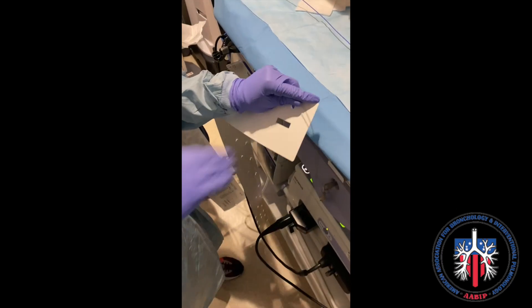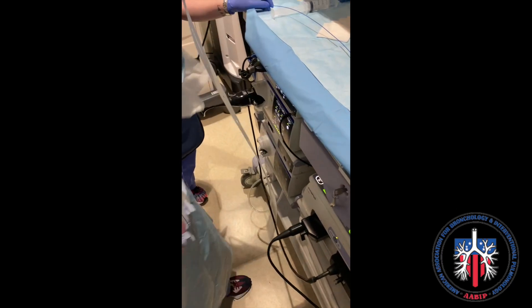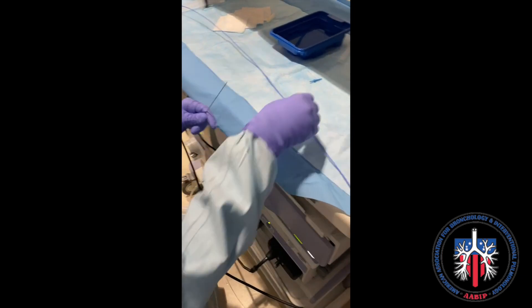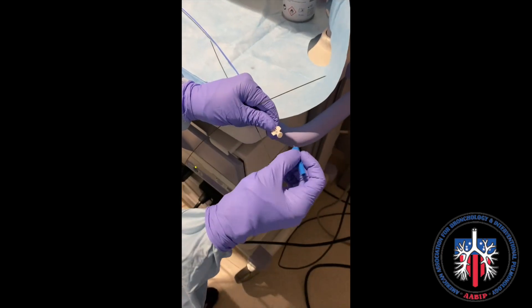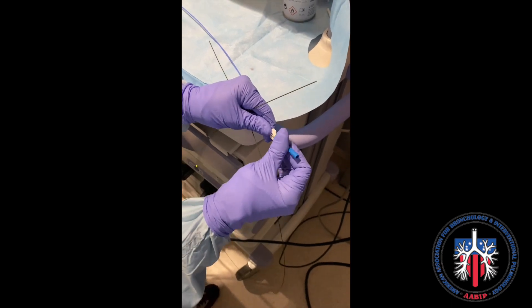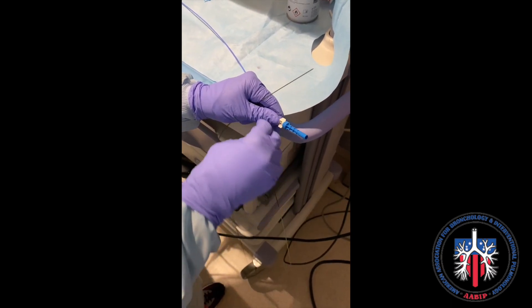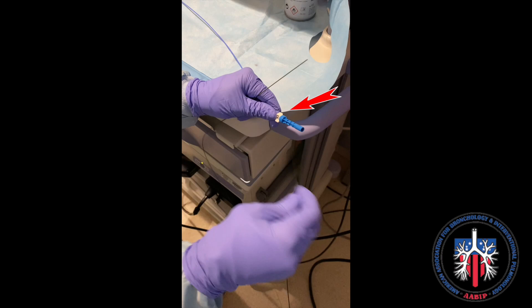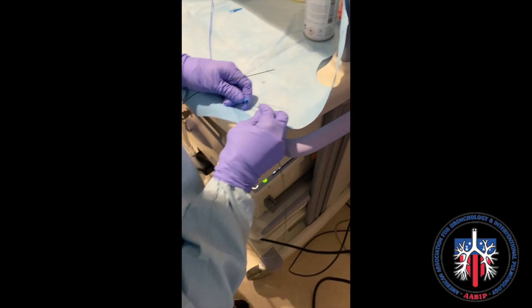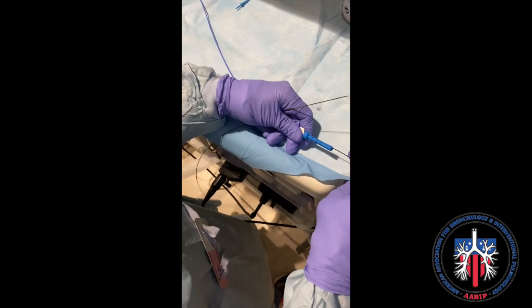Prior to placement of the loader, a measurement of the guide wire is taken to estimate where the end of the guide wire will be. The loader of the fiducial is then attached to the side of the catheter where it is assigned, and then advanced using the guide wire, as seen here.